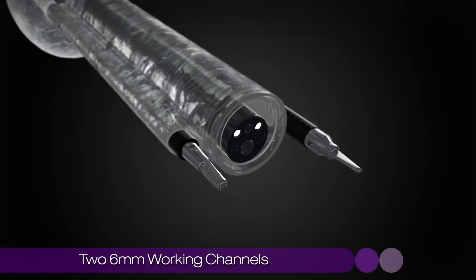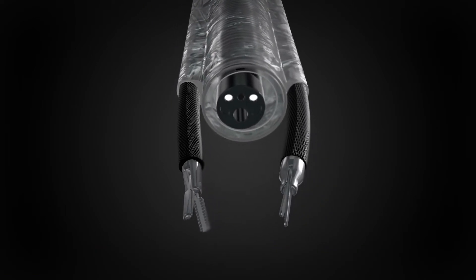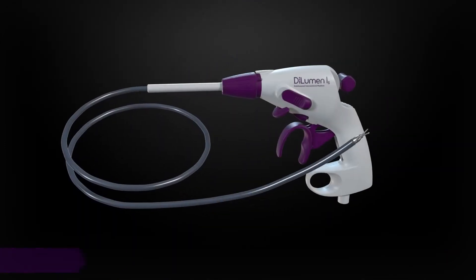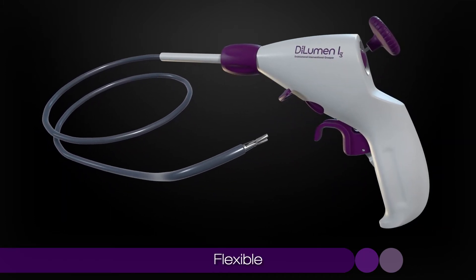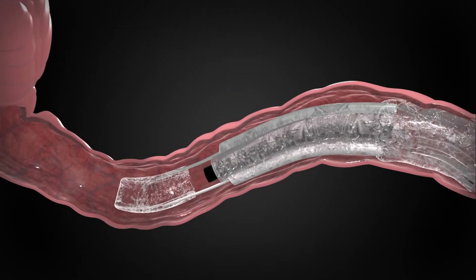In addition, it incorporates two 6mm working channels at the 3 and 9 o'clock positions. These channels accommodate the Dilumen IG grasper and IS scissor. These revolutionary articulating instruments are similar in design to laparoscopic hand instruments, but are flexible enough to navigate through the many curves and flexures of the colon.